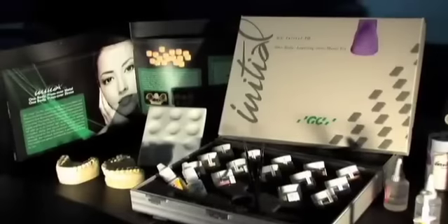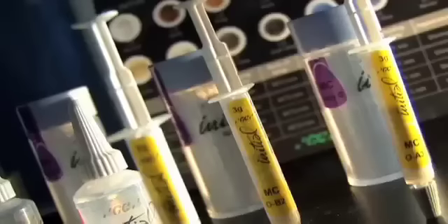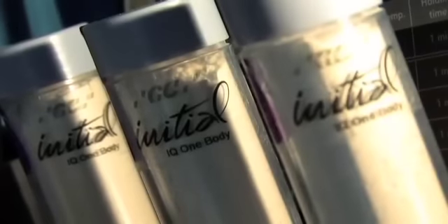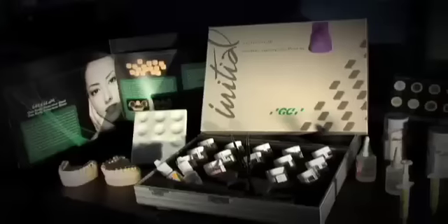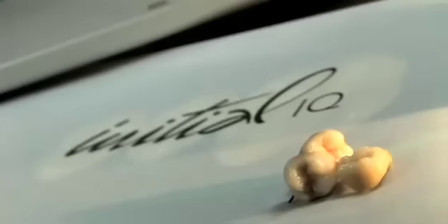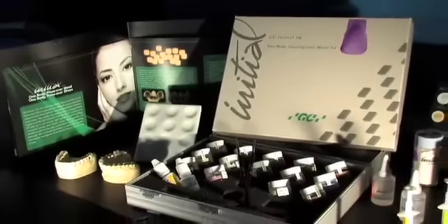The new GC Initial IQ One Body Layering Over Metal concept enables dental technicians to achieve simple and economical reproduction of standard Vita shades by application of a single layer — a true one powder build ceramic without compromising aesthetics. Through the development of this concept, GC can now offer a compact ceramic set for the rapid and trouble-free reproduction of standard Vita shades, enabling technicians to reproduce the same aesthetic results time and again with fewer materials.